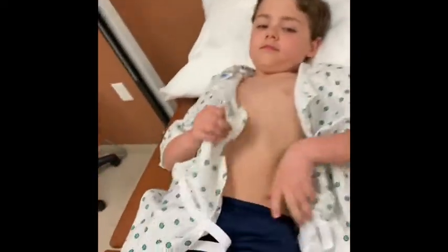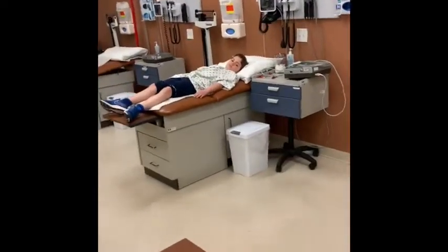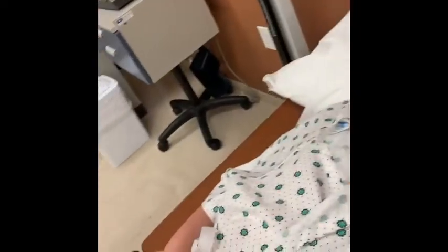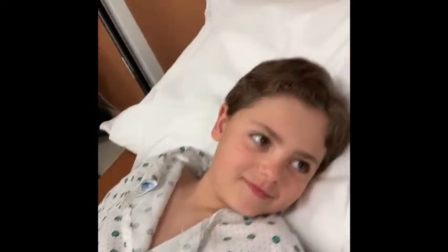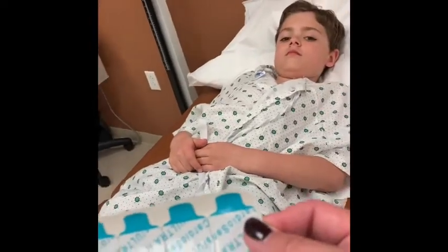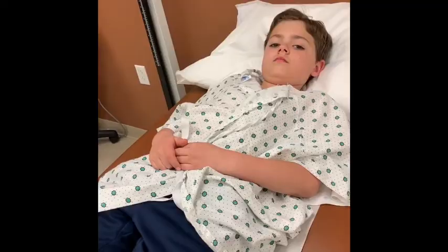So then what I'm going to do is actually clean you off with some alcohol or some hand sanitizer just to make sure that the stickers stick really well. These are the stickers that we're going to use and as I told you guys it's going to be 10 stickers per patient. So if you run out of stickers and you're not done yet you did something wrong, or if you have a sticker left over then you did something wrong as well.